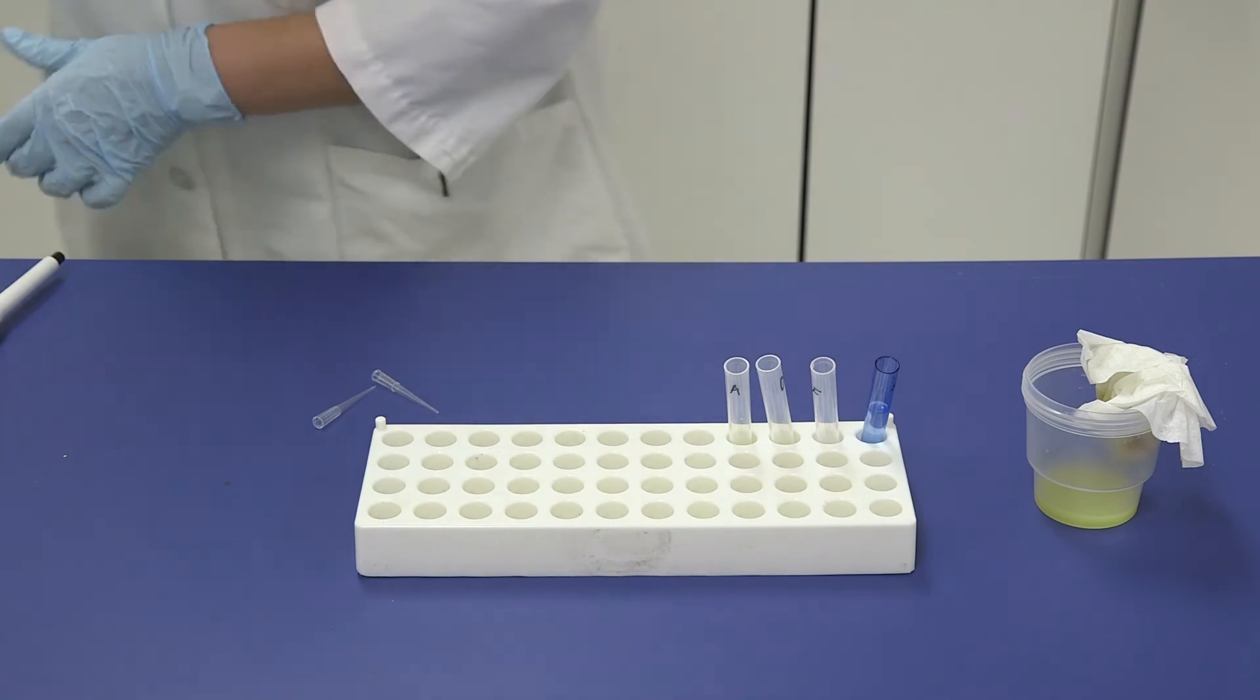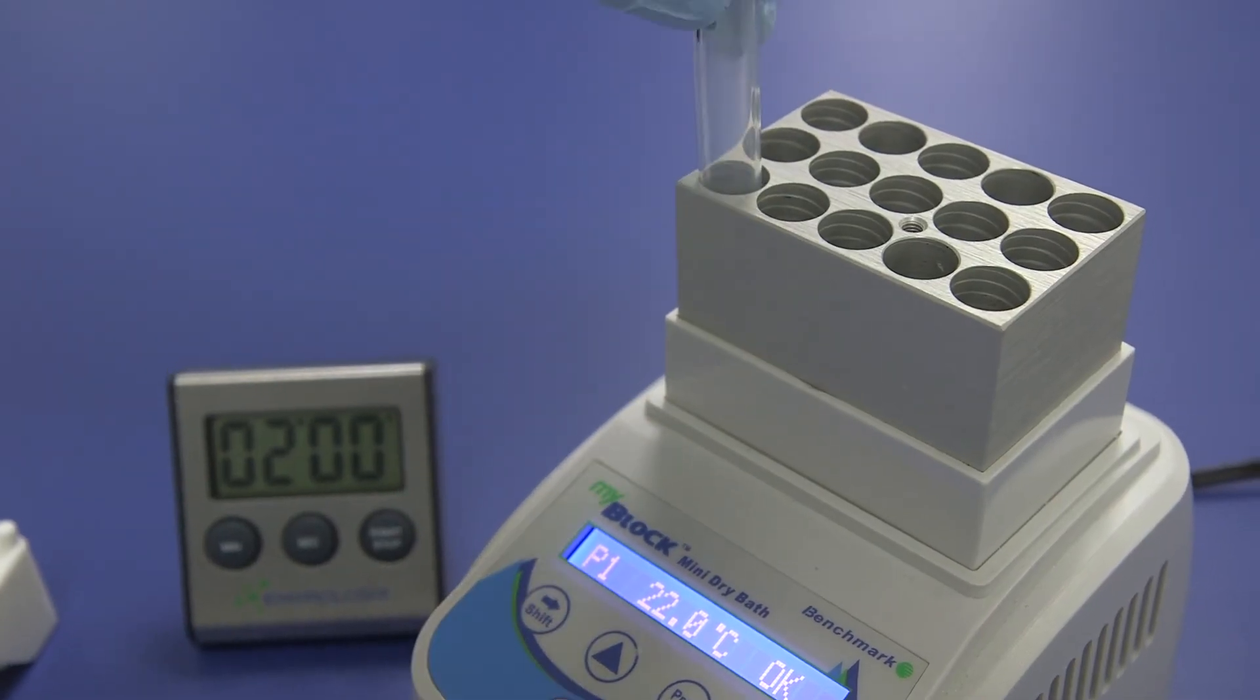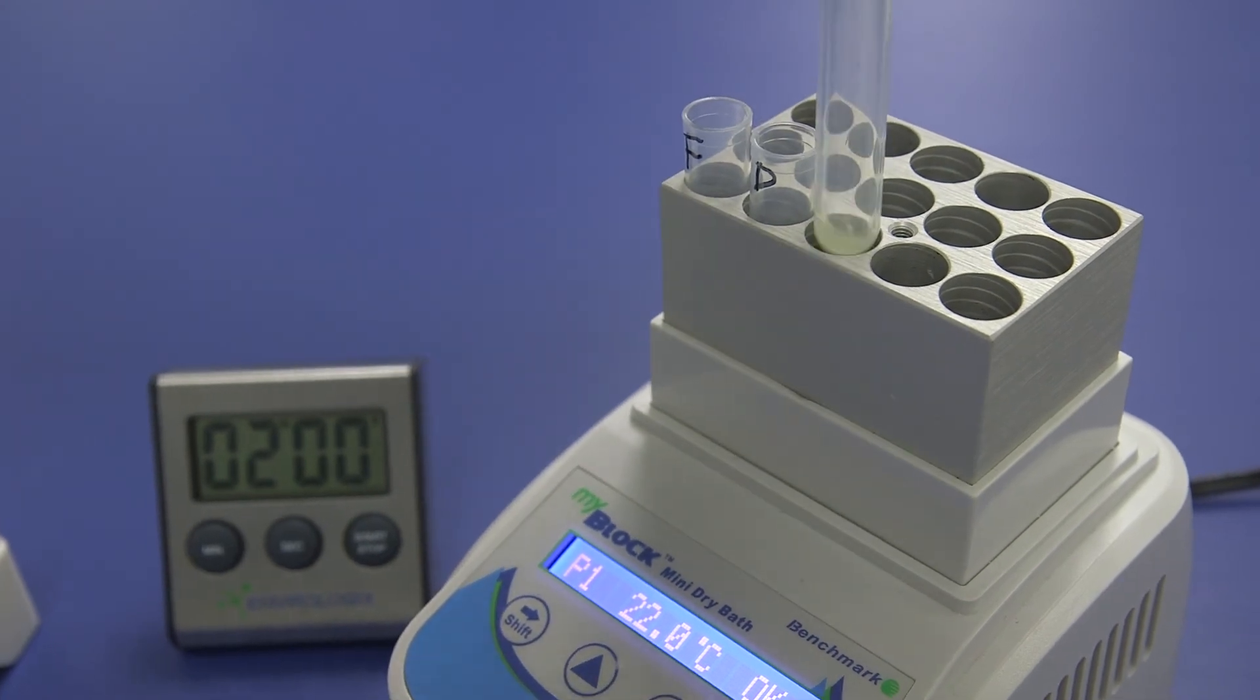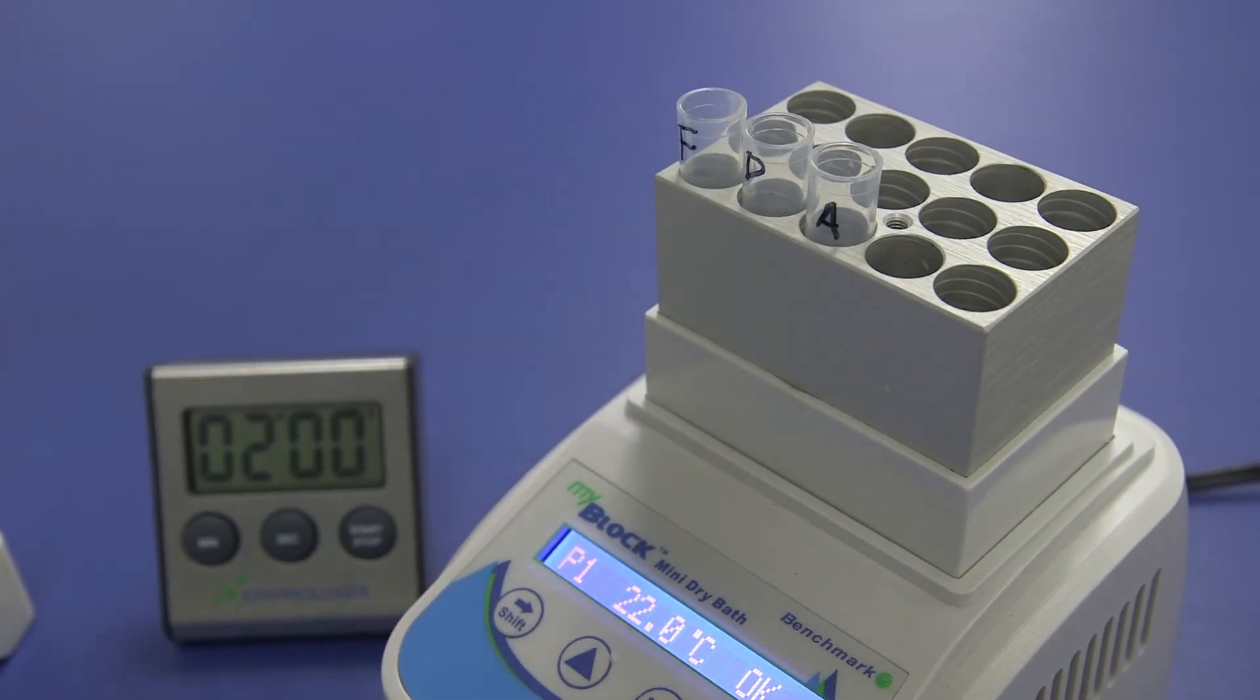Next, place the clear reaction tubes labeled F, D, and A in the incubator and acclimate for two minutes. The acclimation step is only required if room temperature is outside 20 to 24 degrees Celsius or 68 to 75 degrees Fahrenheit.